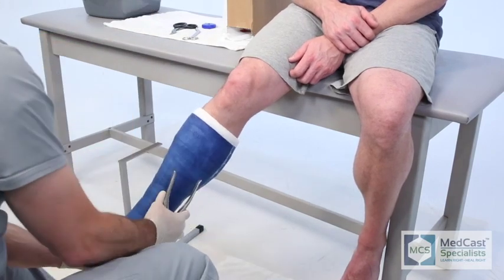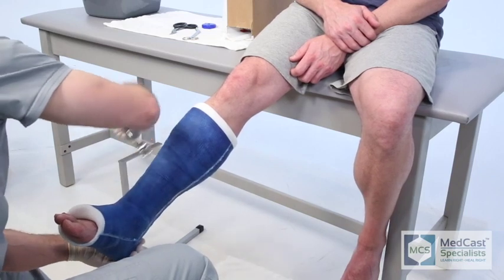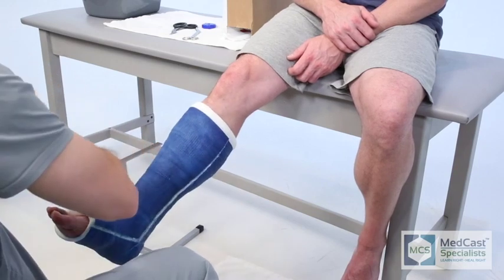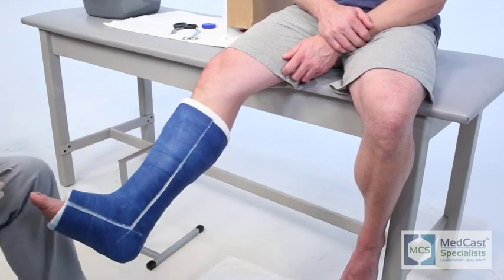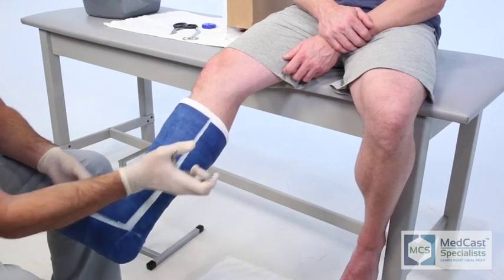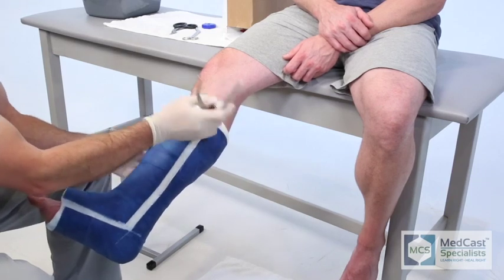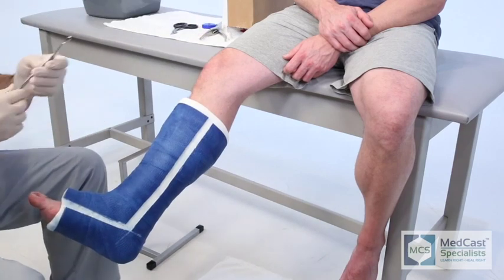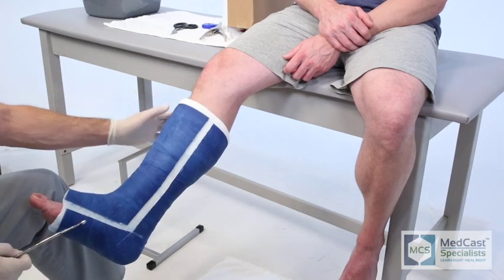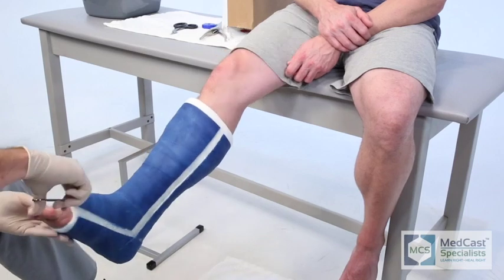He uses his thumb as a thumb guard to keep tension so you can feel as soon as it breaks through the cast, allowing him to guide it and then pull it back. If you're using it freehand without any fingers actually touching the cast, you won't be able to anticipate when it's going to cut through, and that's when you're going to burn or cut somebody. There's always an option of using what we call a zip stick — a thin strip of plastic designed to slide underneath the cast. I try to use it as often as I can if the patient is scared; it gives them peace of mind knowing that the cast saw will not hit their skin.